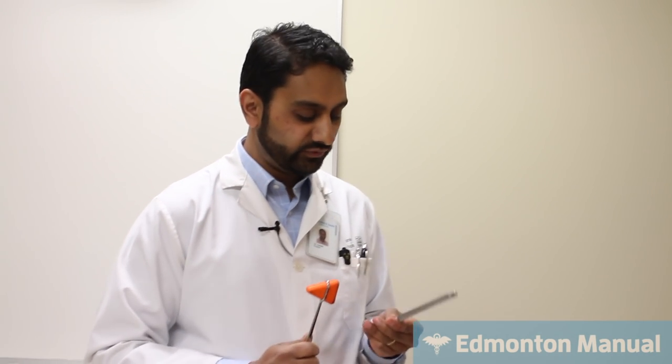So what we're going to do is the Weber and Rinne test. We're going to talk a little bit about this test in the context of using this because it's kind of helpful to understand it. The purpose of Weber and Rinne is to figure out if a patient has problems with their hearing, i.e. they tell you I'm having ringing in my right ear, or I have trouble hearing people who are sitting to the right of me. You need to know which ear is the problem first before you do either of these.